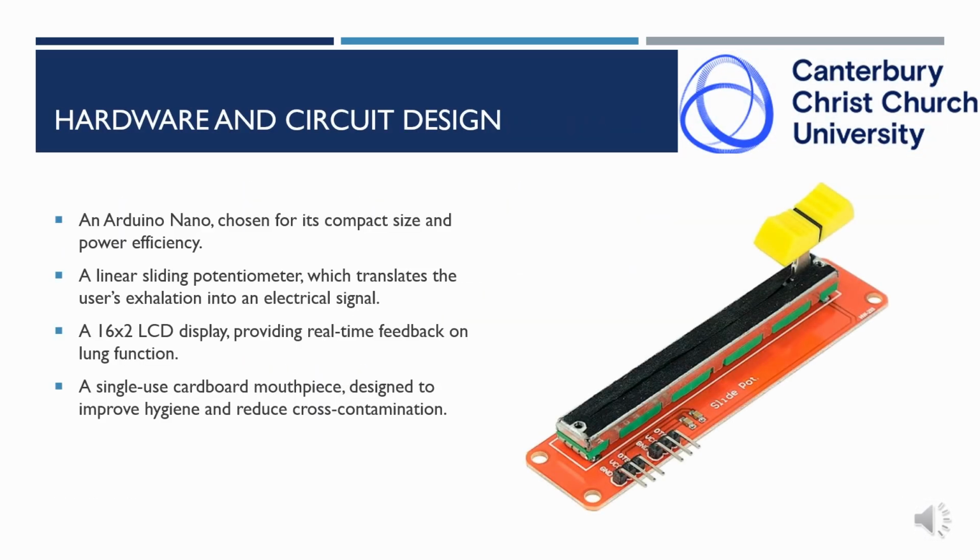The physical circuit was built with the following components: an Arduino Nano, a sliding potentiometer, and an LCD display screen as the main components.